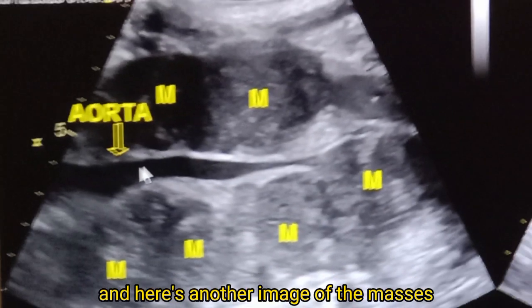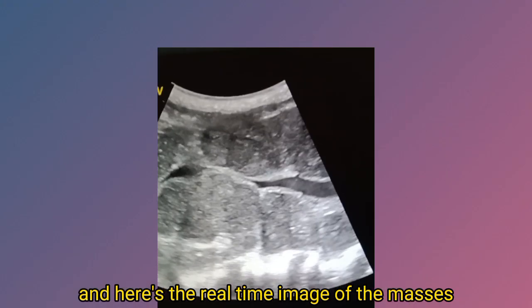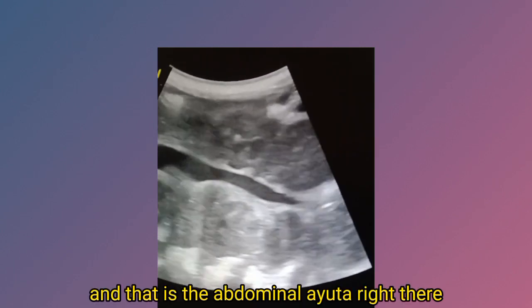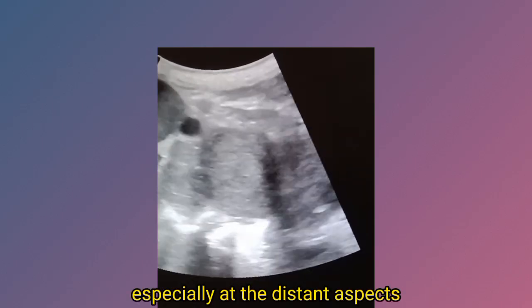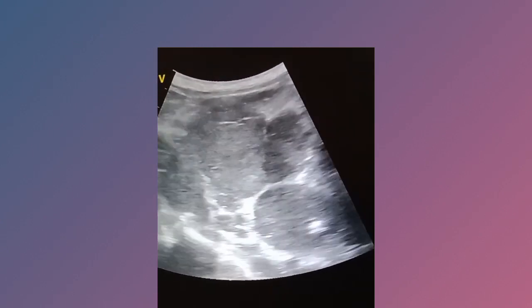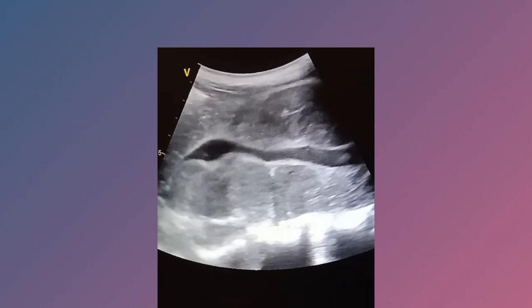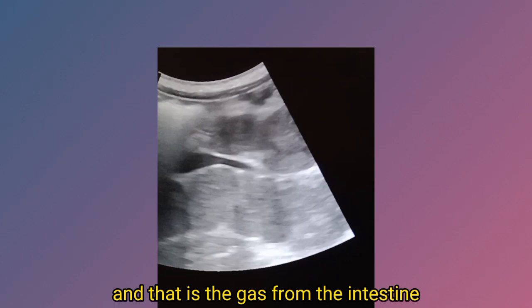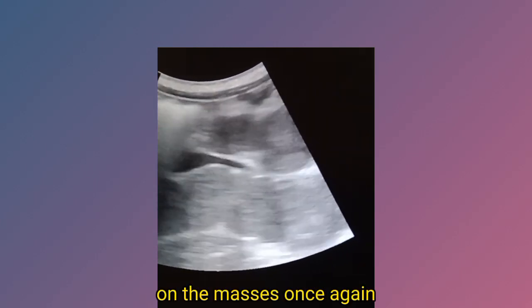Here is another image of the masses surrounding the abdominal aorta. And here is the real-time image of the masses and the abdominal aorta — the aorta is right there being compressed by the masses, especially at the distal aspect.